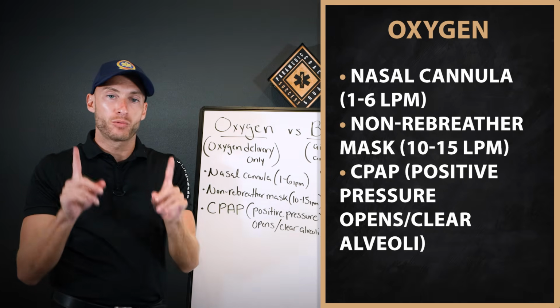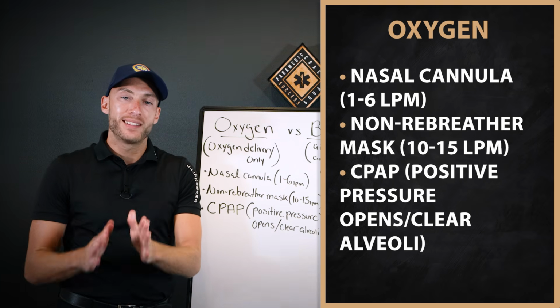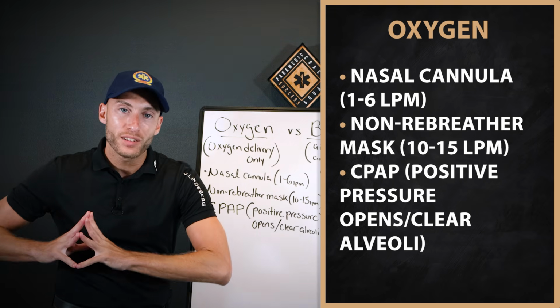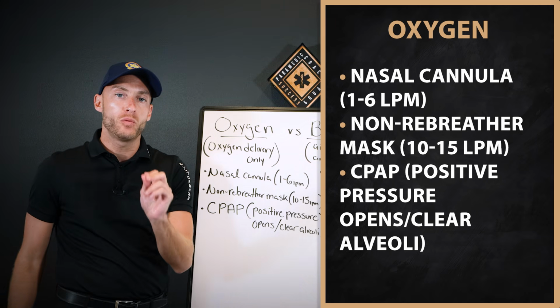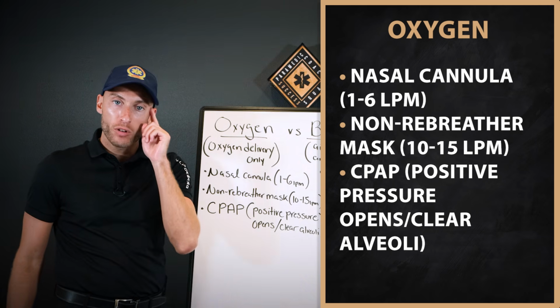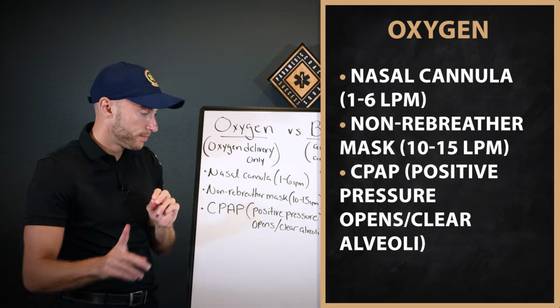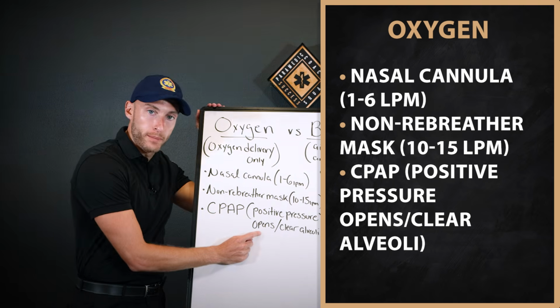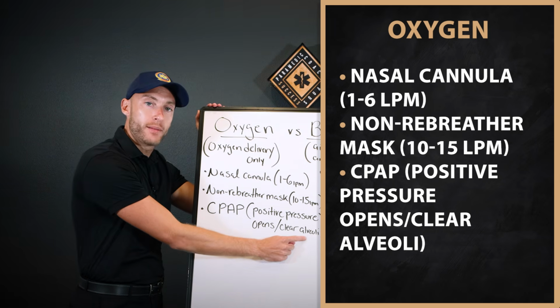CPAP is a device that's really, really amazing. The key thing to realize about CPAP is it's going to push positive pressure down to your lungs. Now, what does that mean and what does that do? Make sure and plant this in your head and let this stick with you. This is what CPAP does. It's going to open and clear the alveoli.